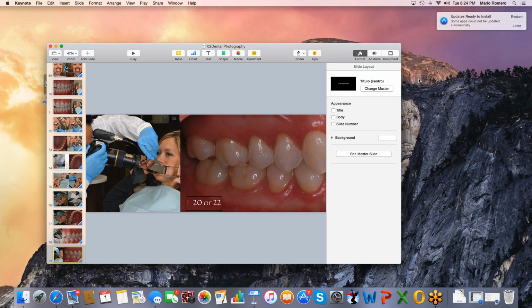The mirrors are around $40 to $50, and you only have to buy a couple of sets because you can sterilize them very well. You can sterilize them in cold solution. You don't want to put them in your autoclave because that will damage the mirror, but you can sterilize them in gas, or with any cold solution and just wipe them off. There are many things you can use today for that. But definitely these are all glass mirrors.